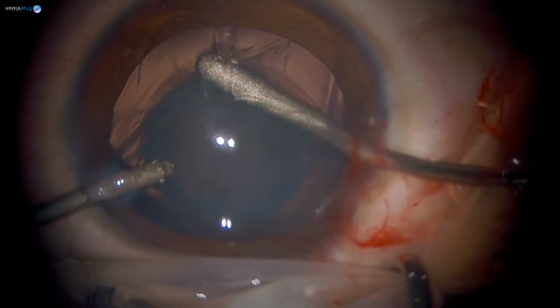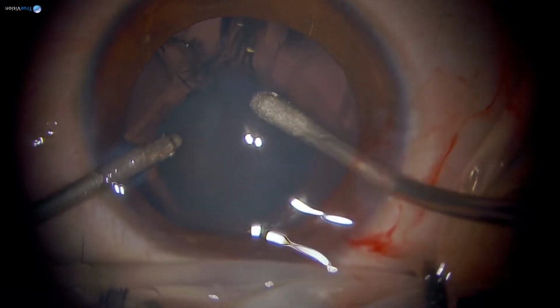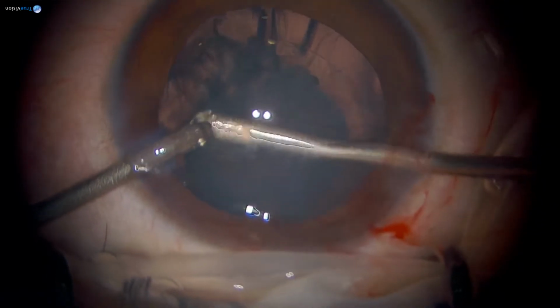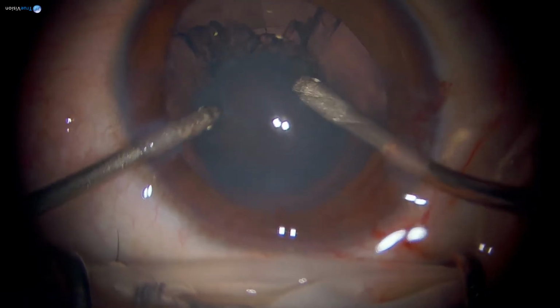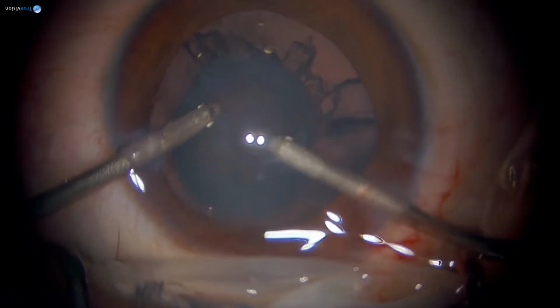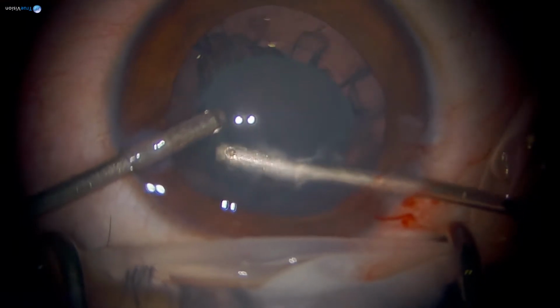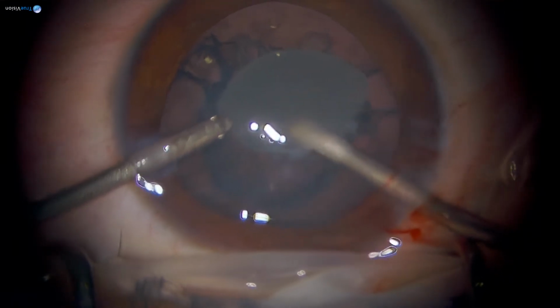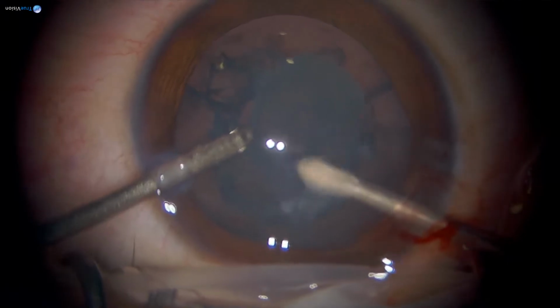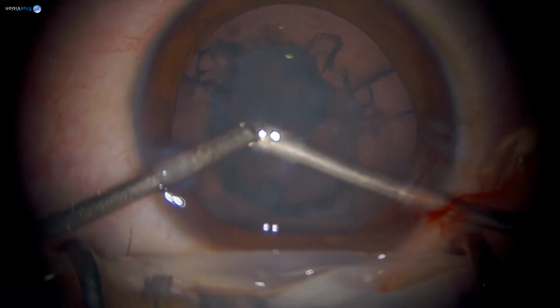And now you're just using bimanual, and this seems fairly soft. Is that correct, sir? It's usually a very soft cataract. I try to aspirate the peripheral part first and then come to the center. The reason is that the nucleus acts as a tamponade against the posterior capsule. So that makes life a bit easier. But sometimes the nucleus can just pop up. It's just like a lollipop. It can just come up. So it's okay even if it comes up, but as much as possible, if you can avoid that, that's fine. So right now you can see that the nucleus is coming in the way. So you can push it back and go for the other cortical matter, or you can just aspirate it.